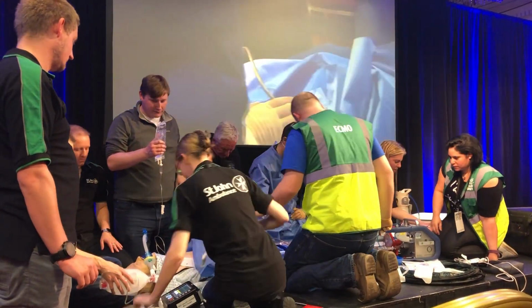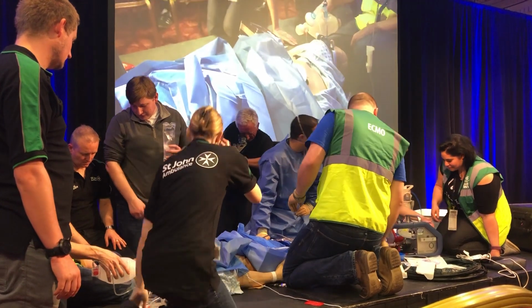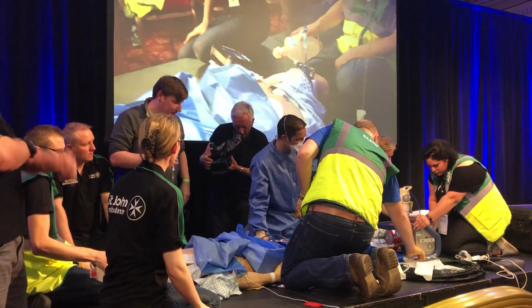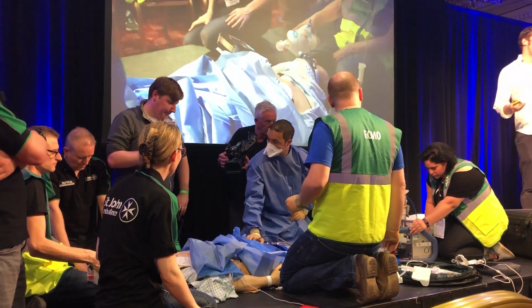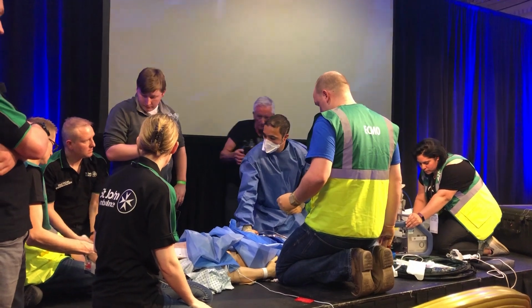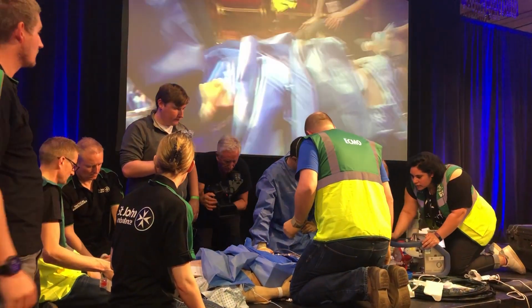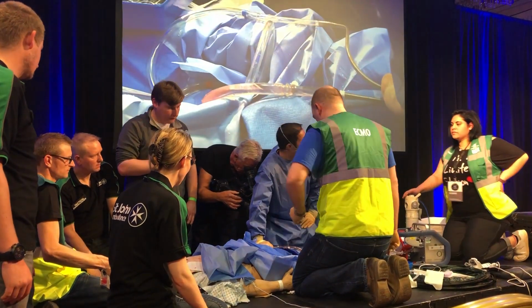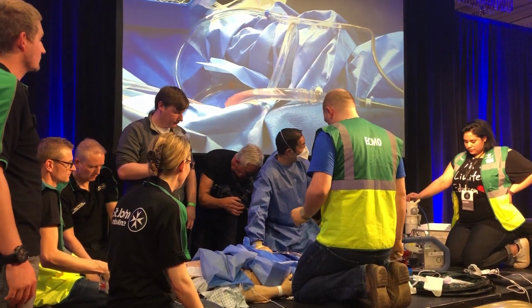Okay, so they're at full flow. At this point we may probably stop compressions. This circuit is draining 4 or 5 litres a minute, going through the circuit, and going back, pressurised, into the artery, up the wrong way up the aorta, which may sound a bit weird, but it doesn't really matter, at least initially.